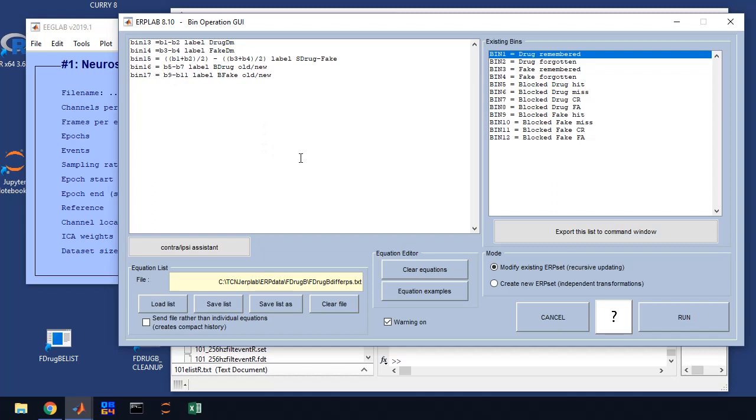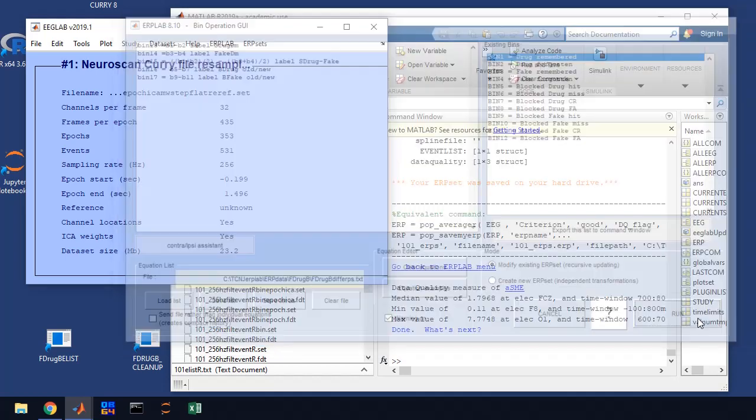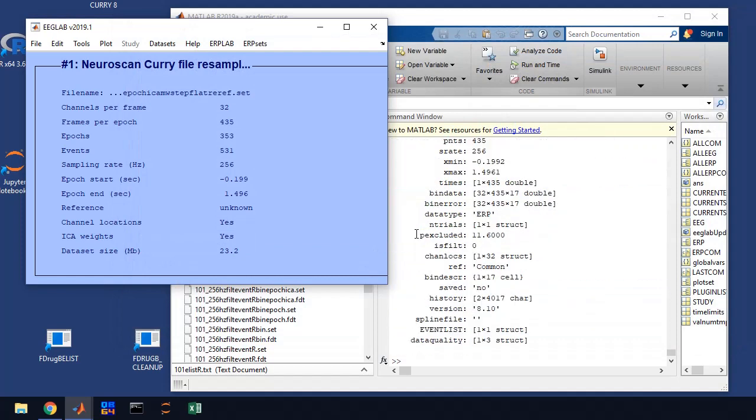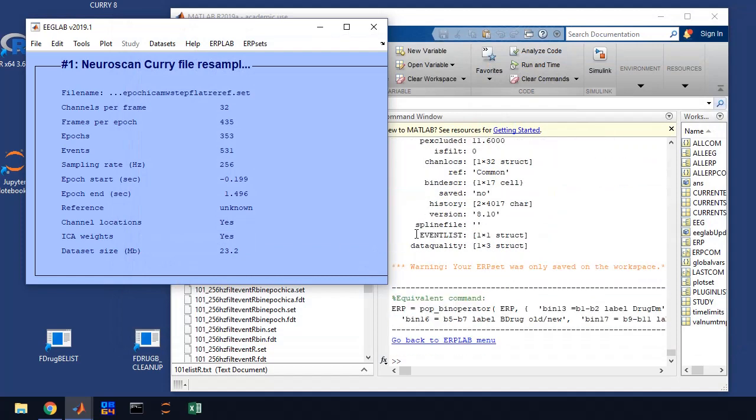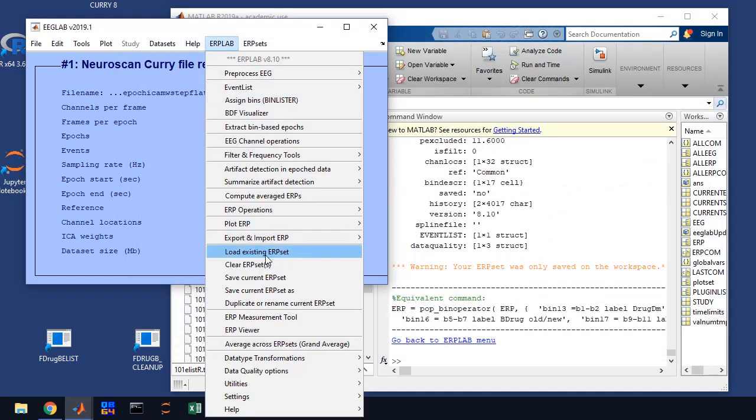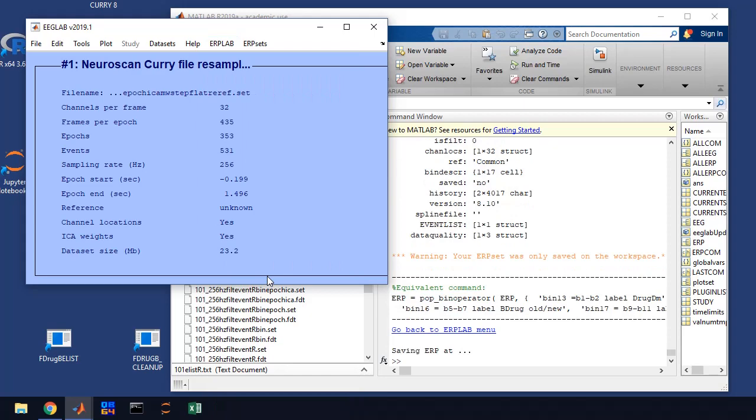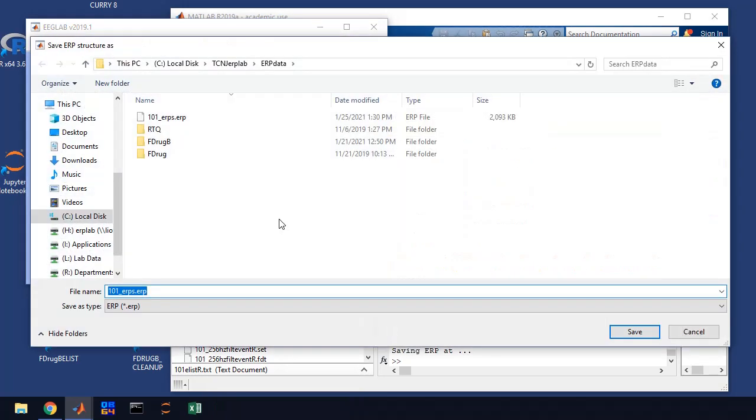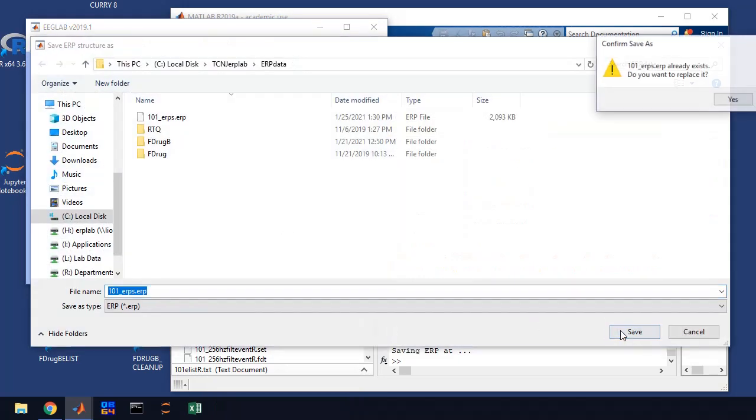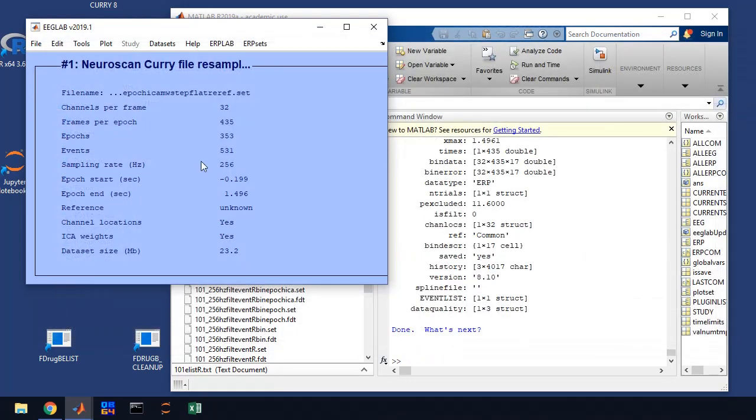So we can do this in our bin operations. You shouldn't have to do much here, it should be automatically populated. There will be a file that saves these bin operations. So if it doesn't get populated, you can load it up, but you're just going to click run and it will create that. Now, what you have to do is you have to save the ERP set, otherwise it won't save those bin operations. It's going to say that it already exists, do you want to overwrite it, and you say yes.